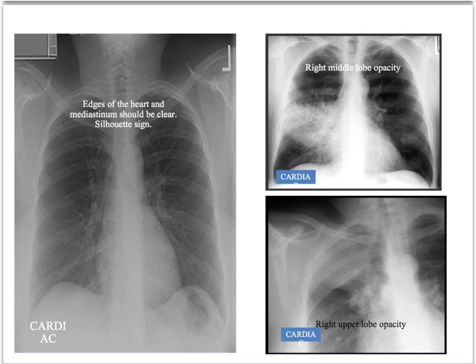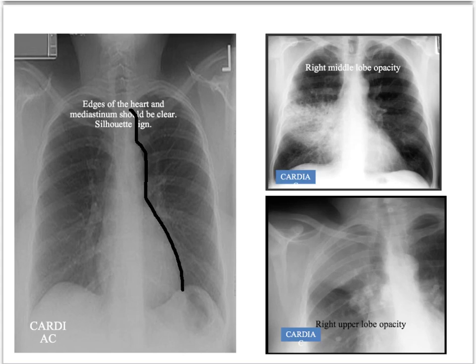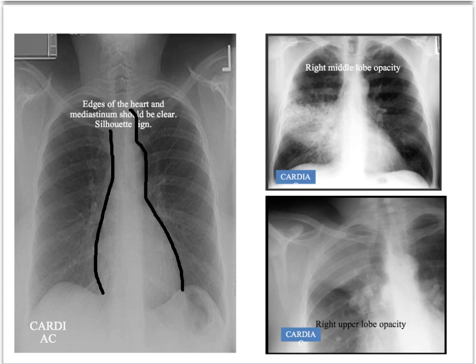Moving on to C — cardiac. This is about looking at the heart and its borders, where the silhouette sign is very useful. The edge of the heart and mediastinum should be clear and crisp. You can easily distinguish the heart edge from the lungs — it is silhouetted against them. If you lose that silhouette, something is causing it to disappear — fluid or solid of some description. In this example with a right middle lobe opacity, you can see the heart border beautifully in some areas but it is completely lost where the opacity is.